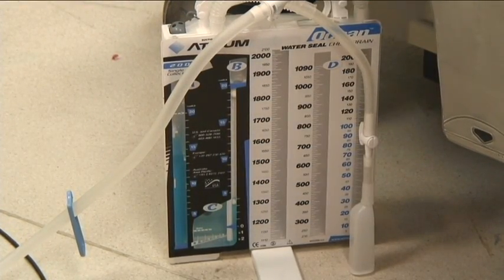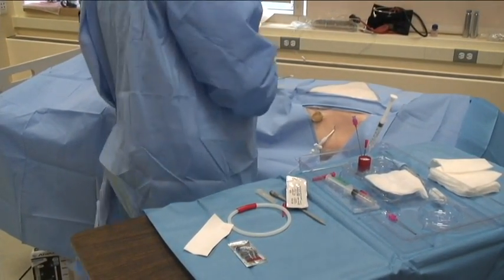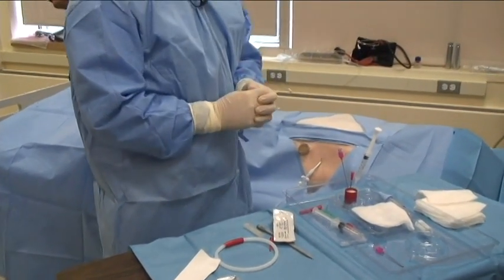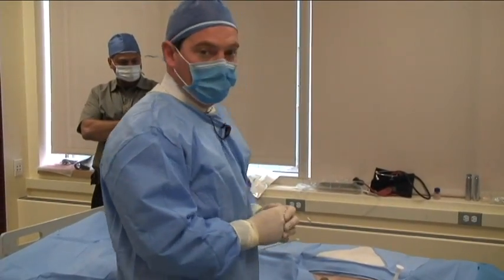However, if you've only put the tube in for a pleural effusion, usually it's adequate just to leave it to the pleurovac on water seal and just let the fluid drain, unless of course a pneumothorax has developed as a complication. And you know, these things require a clinical decision based on the individual patient and the case.